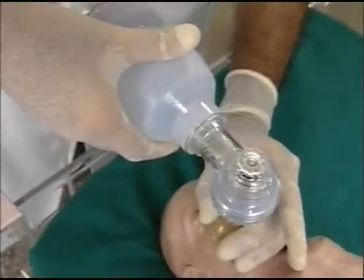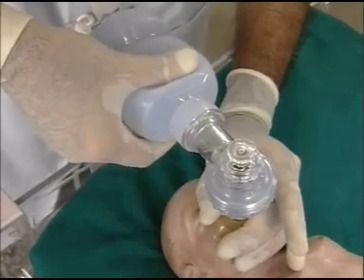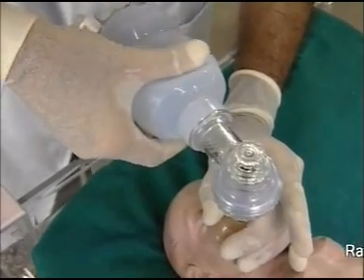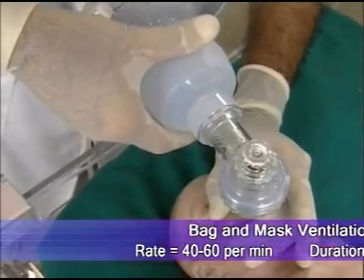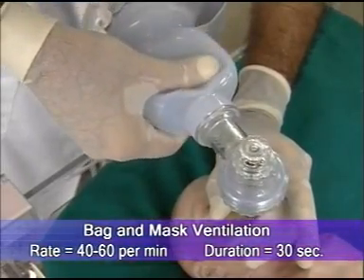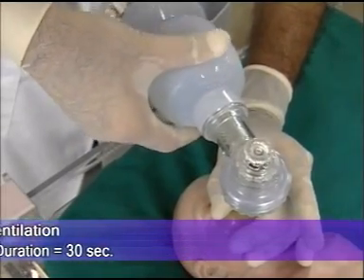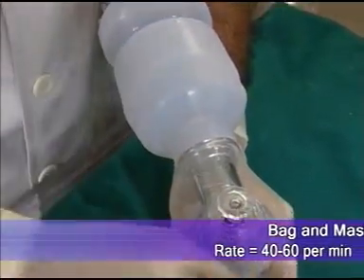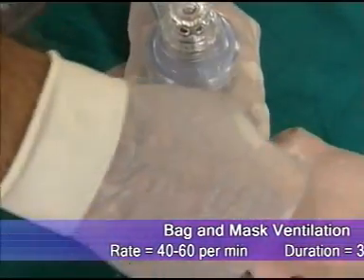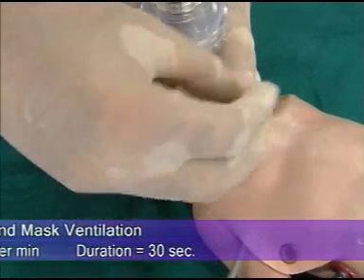Bag and mask ventilation is conducted as follows: when you squeeze, this is inspiration; when you release, that is expiration. Squeeze — one, two — expiration. The eyes of the bag and mask ventilator should be on the nipple of the baby. When you give the pressure, do check that the chest is moving.